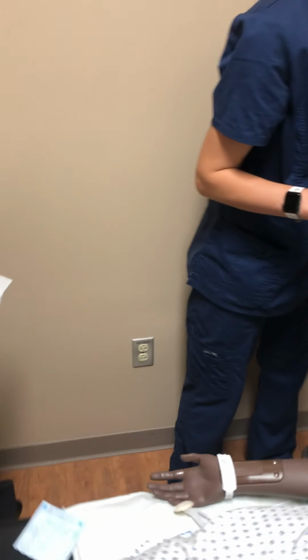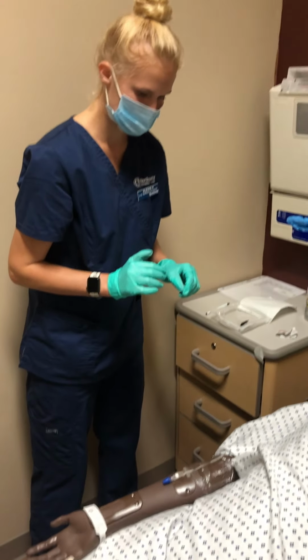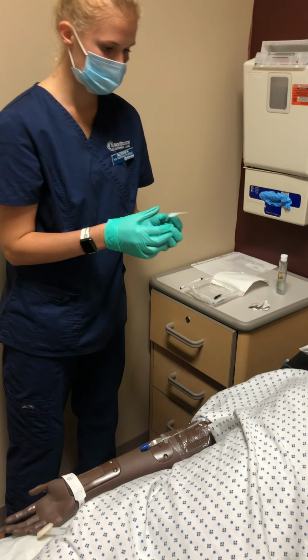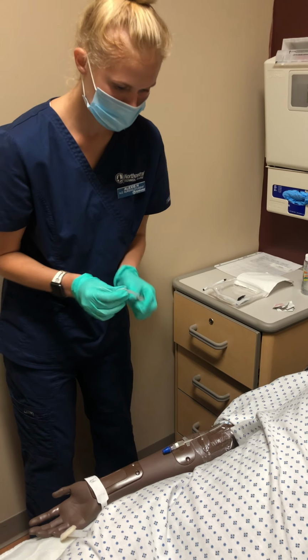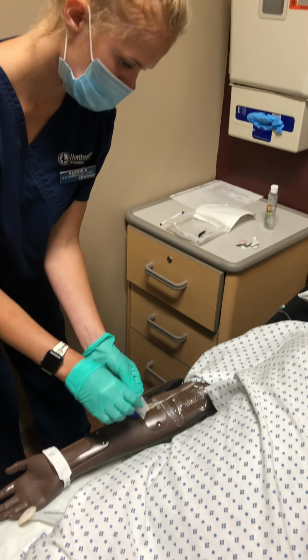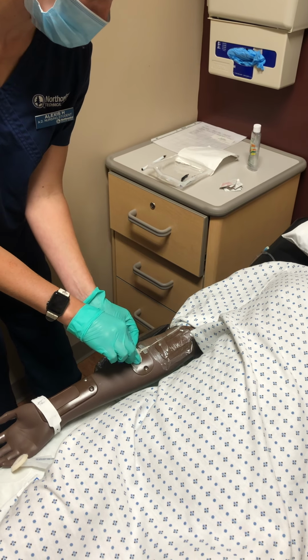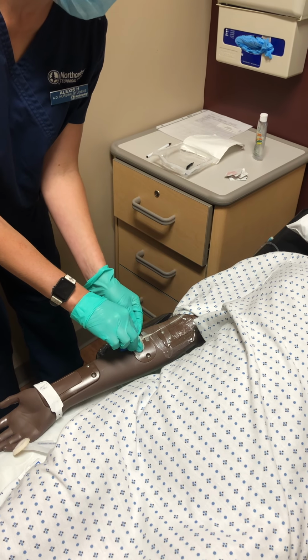And then I want to tape with my initials, the time, and the date. Tape. So we can stabilize our device here.